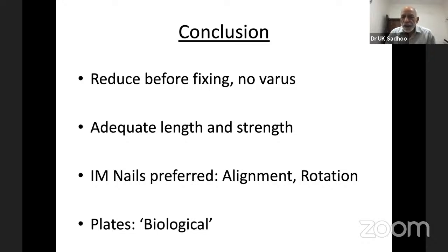This is why the pelvis X-ray is such an education, because you have a normal hip which tells you what is the native neck shaft angle. So try and aim at least a minimum that much, if not 5 or 7 degrees more than that.